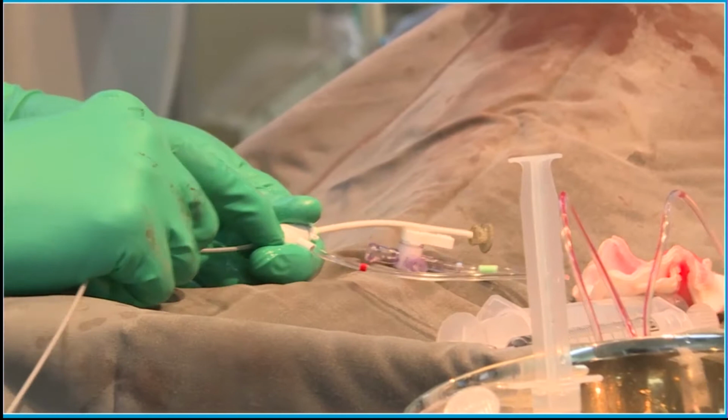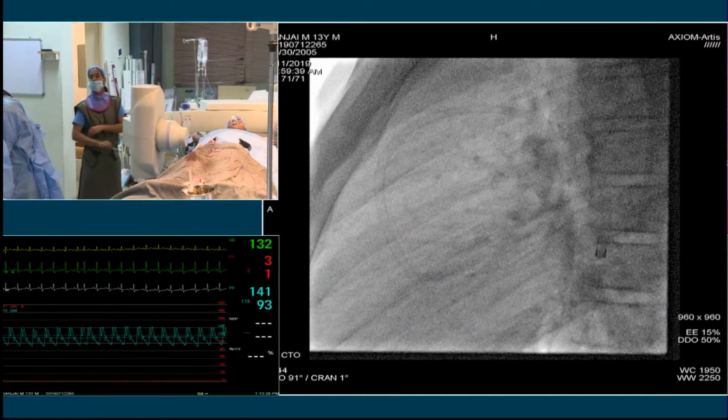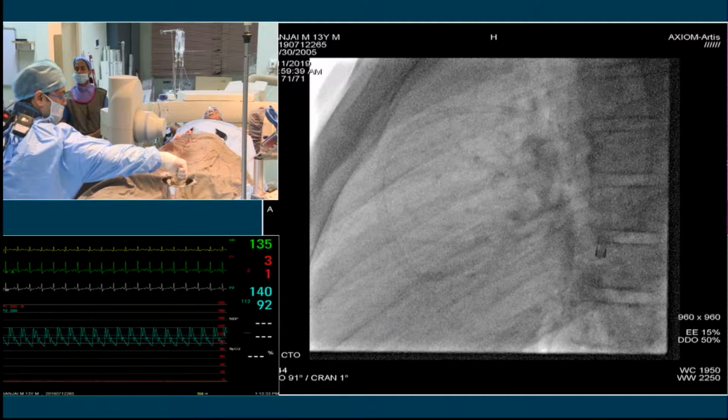Yeah, I agree with Dr. Bharat because of their claims. I have not used these devices much. And when I used this device, I was very disappointed that they made the screw cable rather than the ASD cable, which is like a ball and socket, which is much nicer, because then you won't have that much recoil on the device like we see with the Amplatzer.